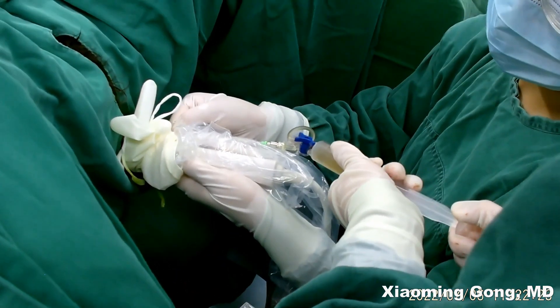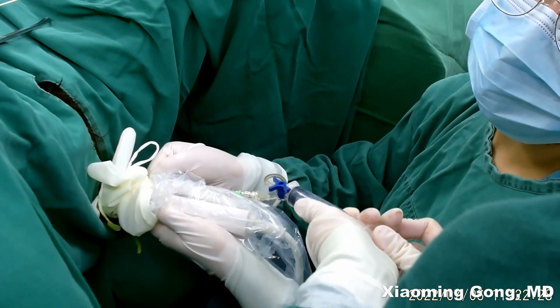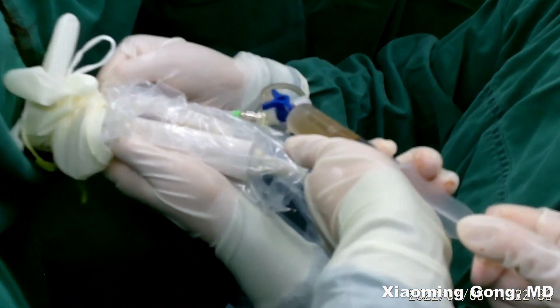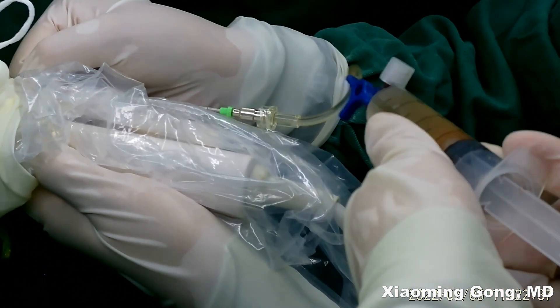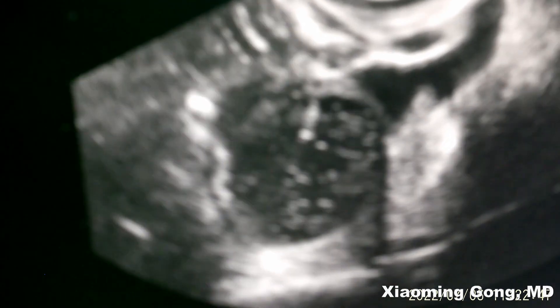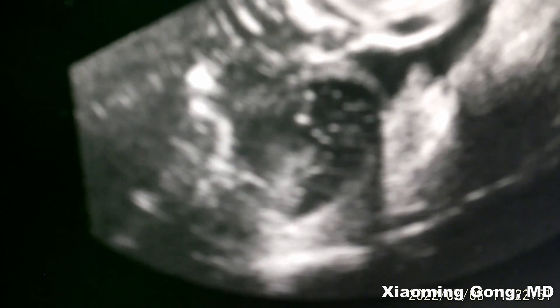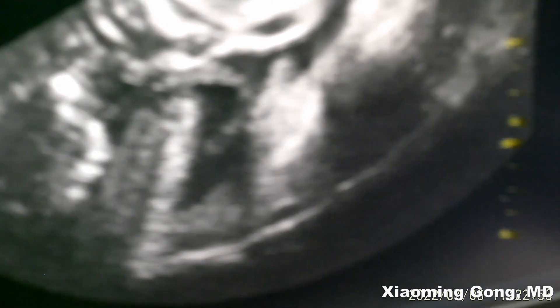We use 95% alcohol to perform the sclerotherapy. Before the sclerotherapy, we have to wash the cyst with alcohol once again to ensure it is clean.